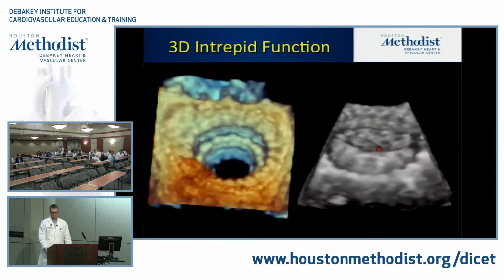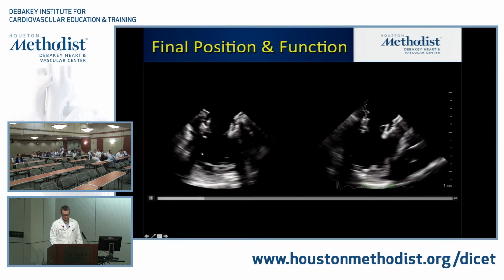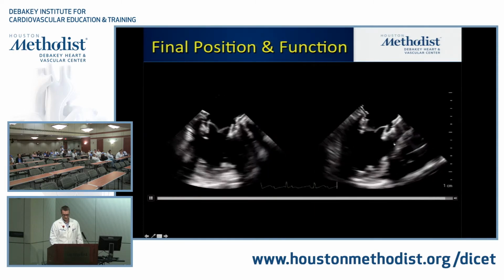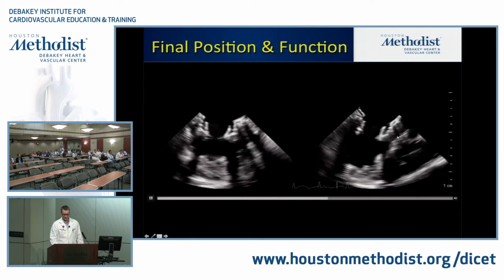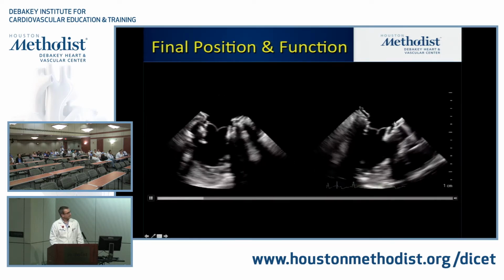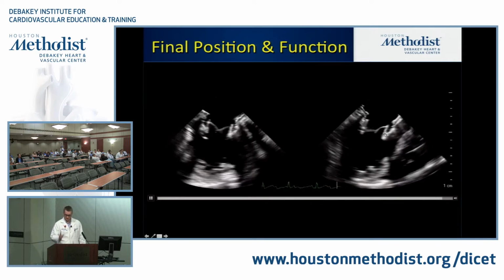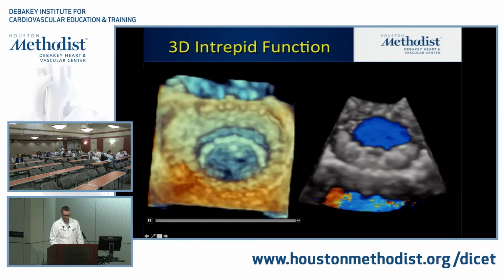Can you go back to the previous? Is there a space between the LVOT and the valve there? Up, no, below, just on the left, on your left. That. Yes, that there. That's a good point. I'll show you on the other slide. The 3D shows it. It has this groove all the way around.